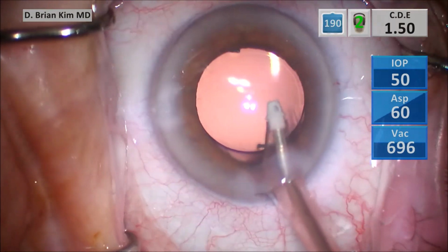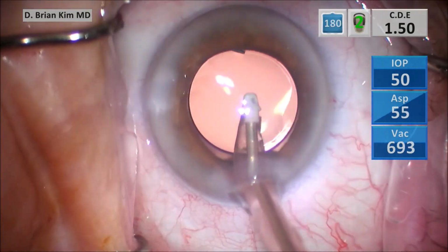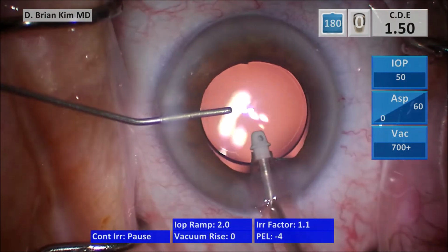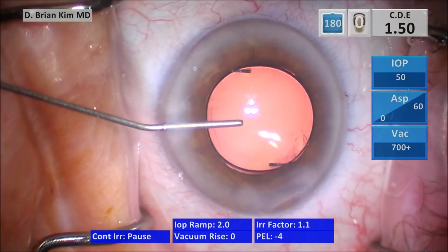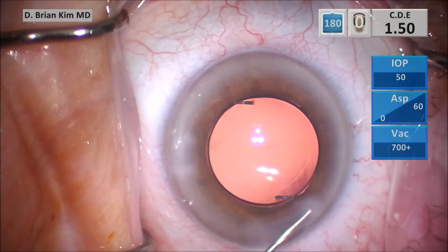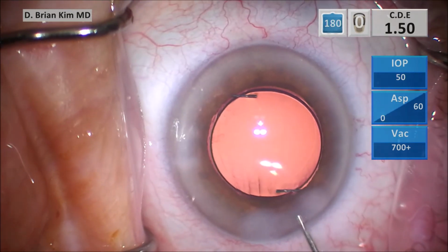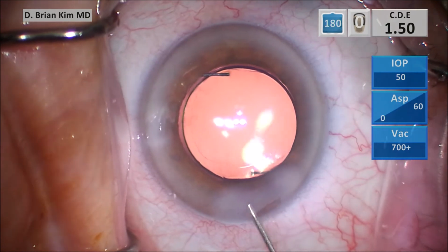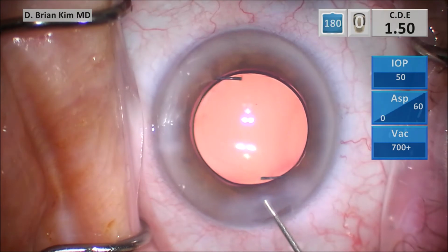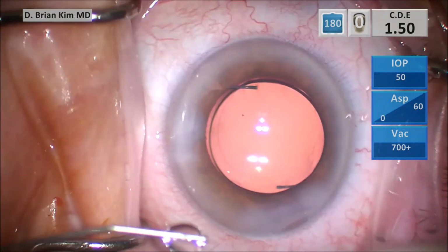People always debate whether or not you can use a lot of ultrasonic energy. Some believe, oh, you can use as much energy as you want as long as you have the cornea coated. But the problem is the cornea is coated with an invisible viscoelastic, and you can't be 100% sure that the cornea is totally protected if you're going really with high amounts of ultrasonic energy. And so, in my opinion, the best way is to develop a habit of utilizing reduced amounts of ultrasonic energy. By doing it that way, you are assured that at least you're keeping that component out of the equation.